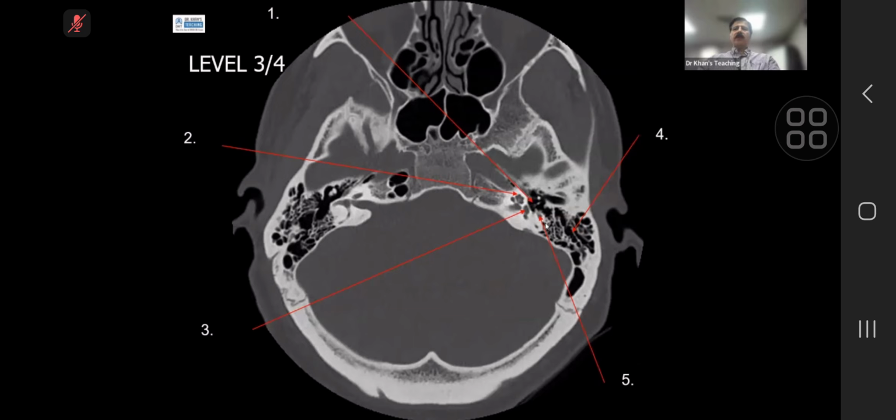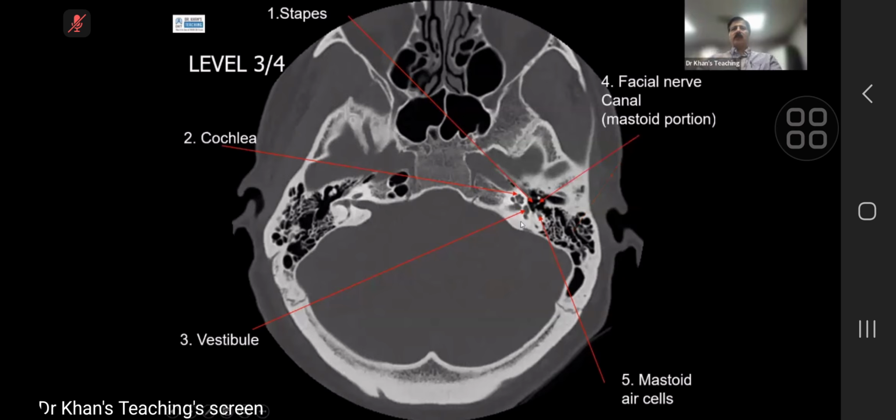Okay. Number four. Number five. Pyramid. Okay. Let's go through them.